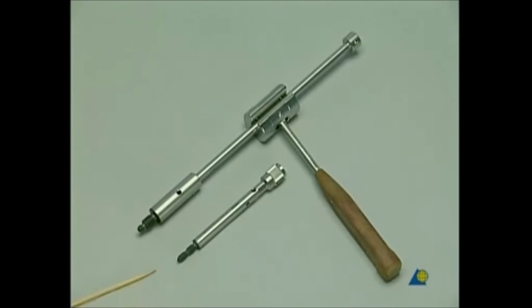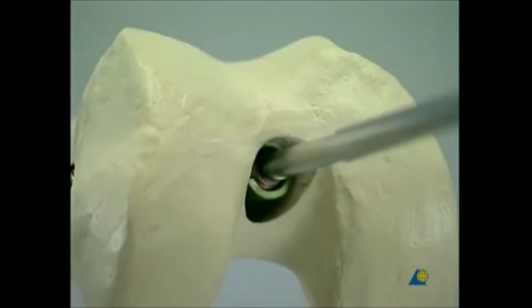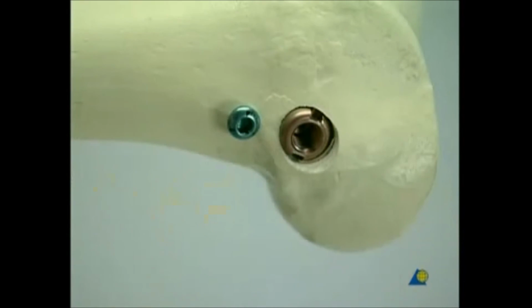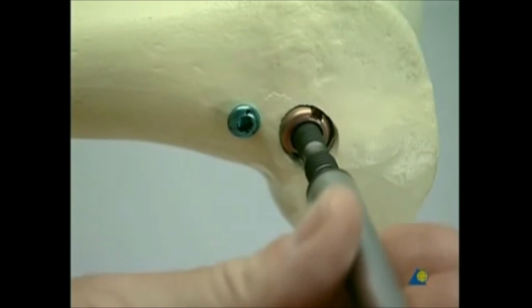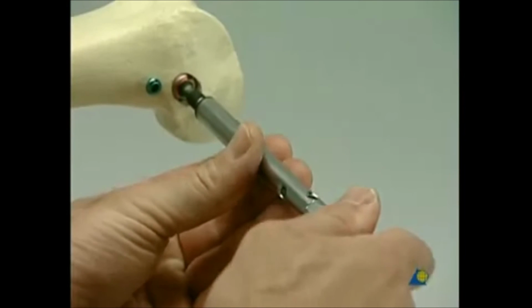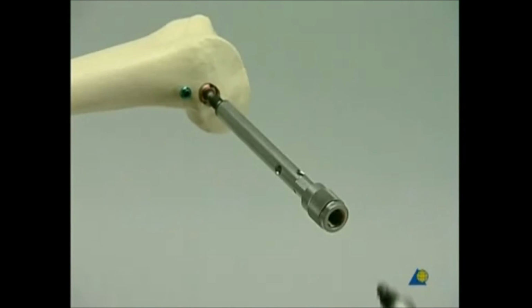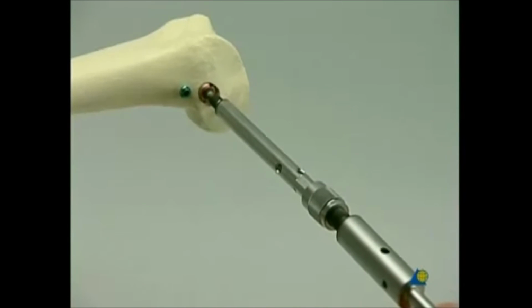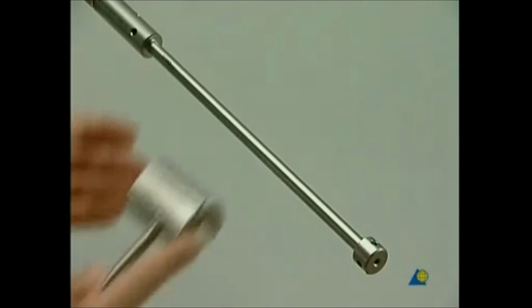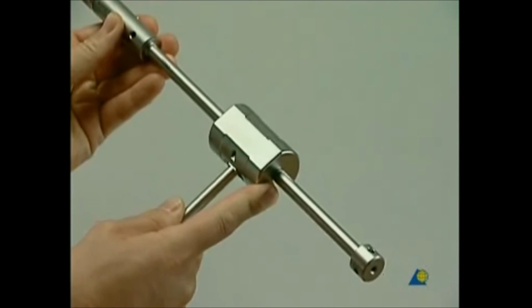Needed for the removal of the DFN are an extraction screw and a hammer guide with slotted hammer. First, the end cap is removed. Then the extraction screw is attached to the spiral blade and tightened. After that, the hammer guide is mounted onto the extraction screw. The blade can now be removed with the slotted hammer.